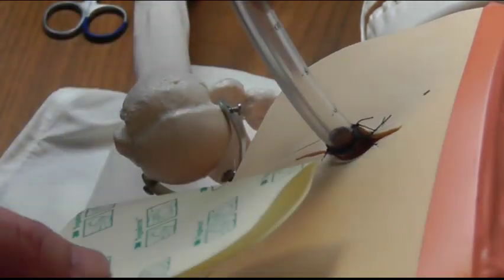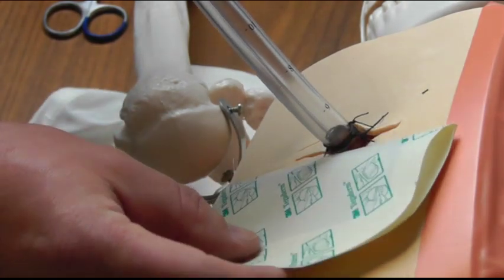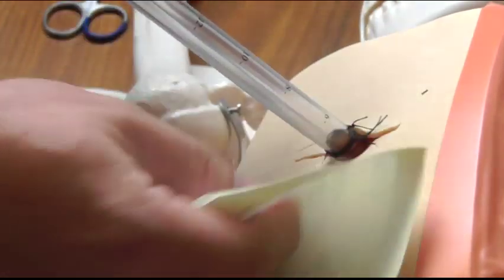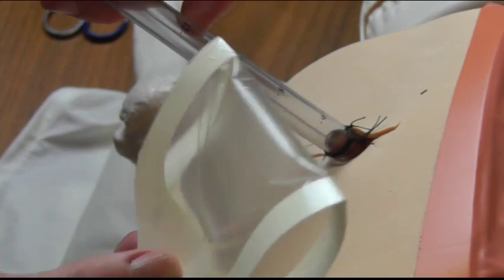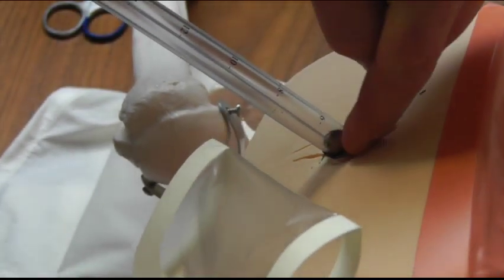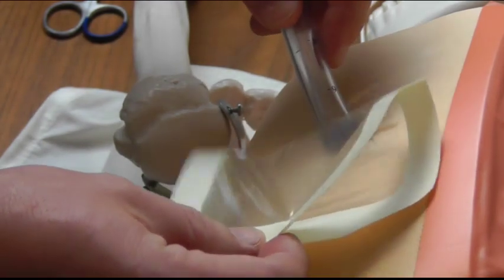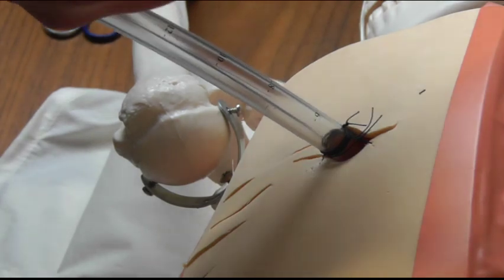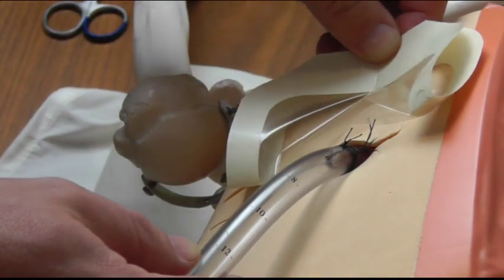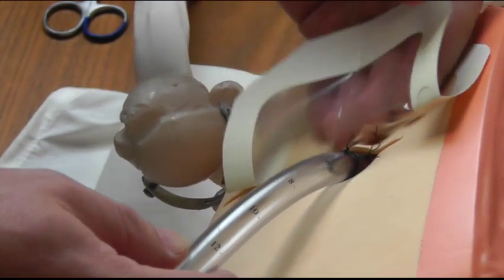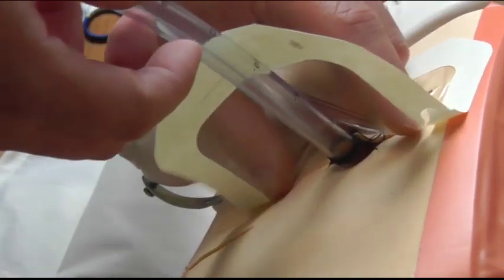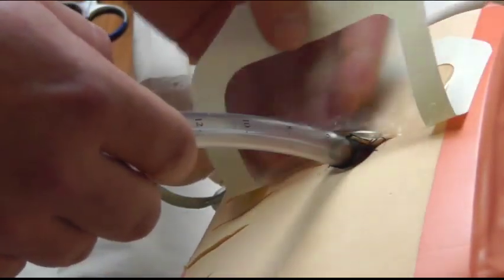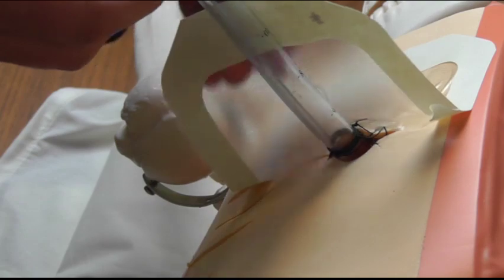You'll see once the sticky stuff comes off, you try and fold your tube out of the way, get it right into that crevasse there, stick it down on the chest and then fold it up. So we'll just have a quick go at doing that. You can see once it's, because you've folded it, there's a little bit of extra shape to it. It makes it easier to get this edge right in there. So what you want to do is fold your tube away a bit. I'll do the other one first. It might be easier to see what I'm talking about. You want to get the edge of it right up against the tube, down on the patient's chest, push down and then bring your tube back up, stick it up along the tube. You can even probably push that down a little bit further on the skin. The risk is when you stick it to the tube too high, it'll pull off the skin or it'll pull away from the skin.